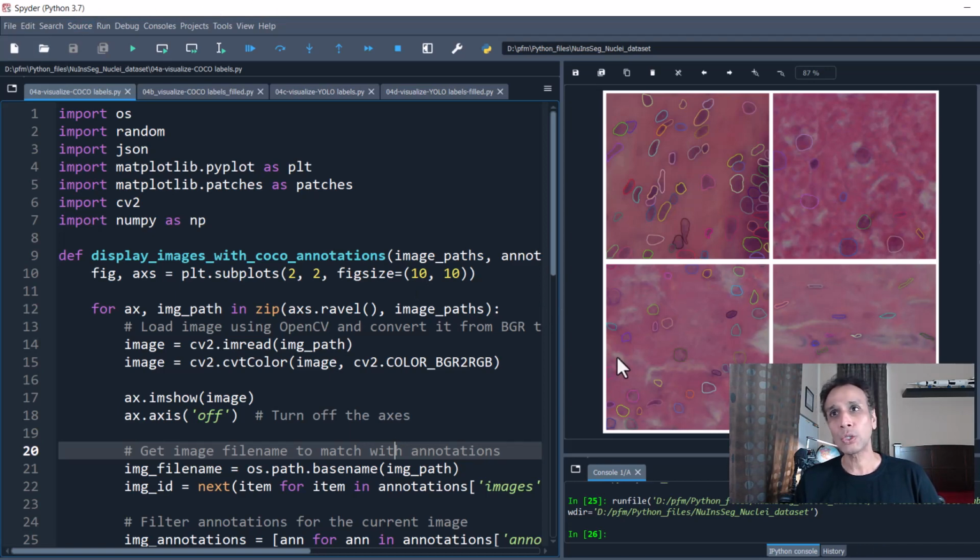You can choose to normalize. I have done videos in the past where you can apply normalization to these pathology images, so the background, they all look the same. If you want the model not to struggle much, that's a pre-processing step that I definitely recommend doing. Again, I'm not going to do that now, but watch my previous videos on this topic of normalizing H&E stains and separating HE DAB signals and all that stuff.